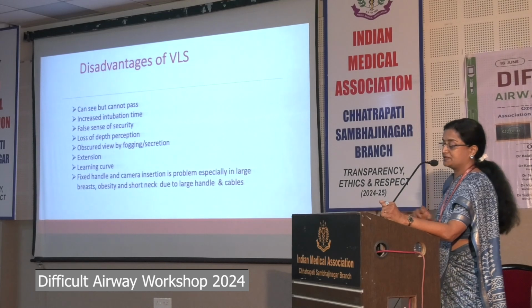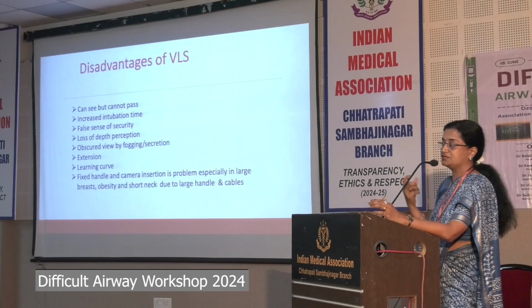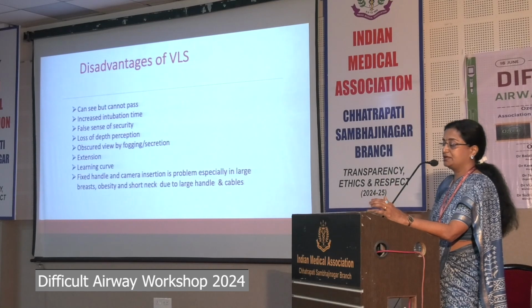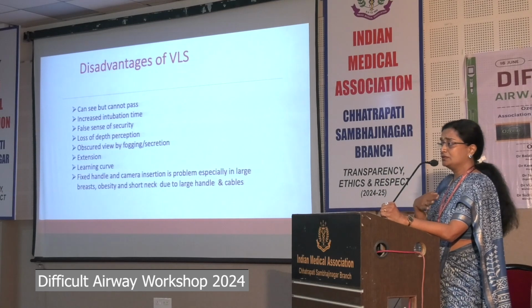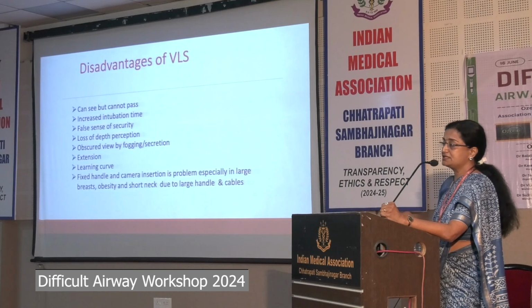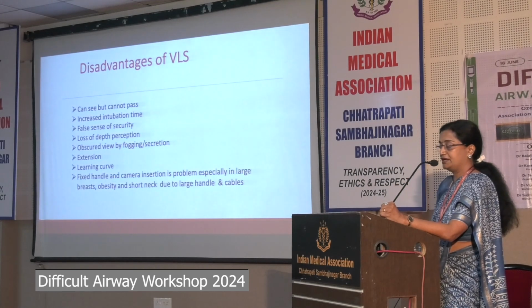Loss of depth perception is there, and the view is obscured by fogging and secretions. If you reuse the disposable blade, you get a lot of fogging. You need extension, and there is a good learning curve in this, and it is the same with different scopes. You have to adapt yourself.